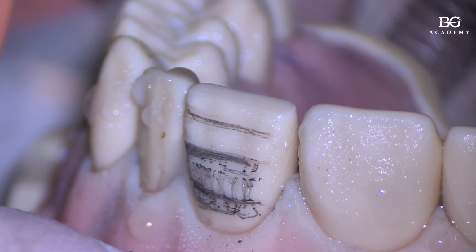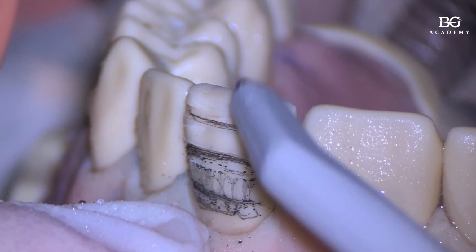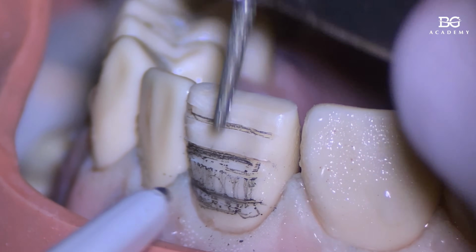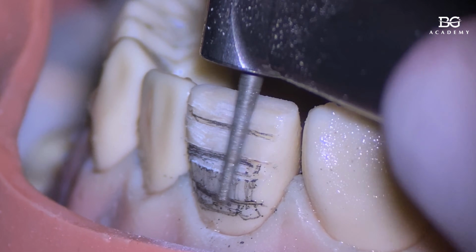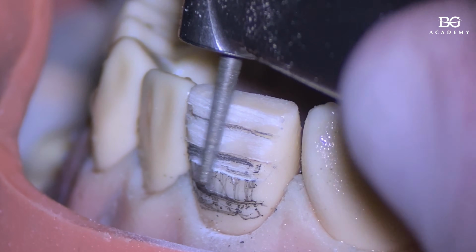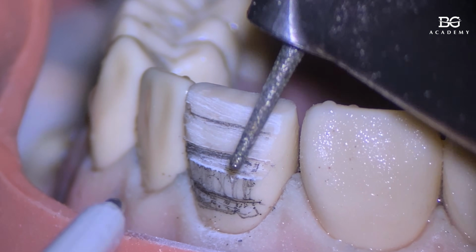Let me switch off the water. It will also be very nice to see the area of bur interference and the surface. You see? So that's the area.